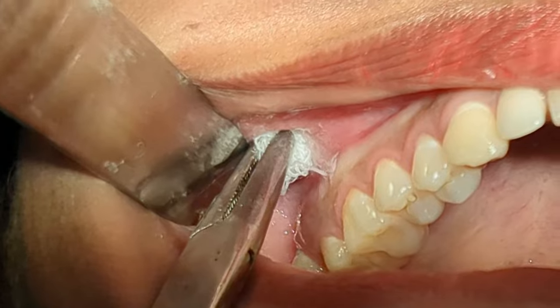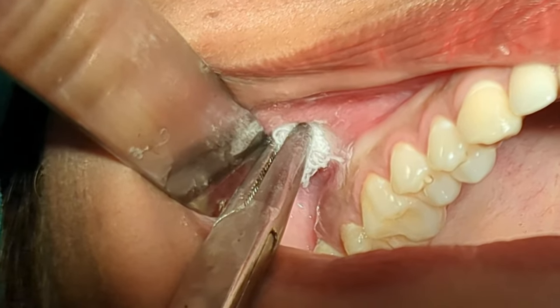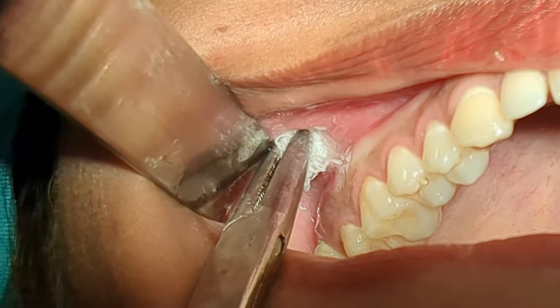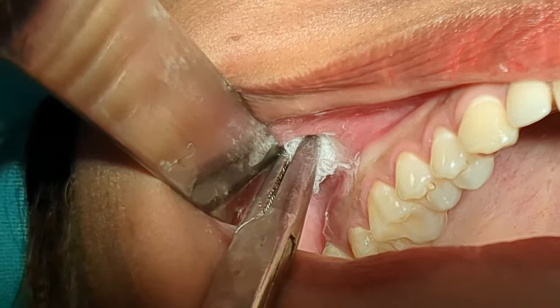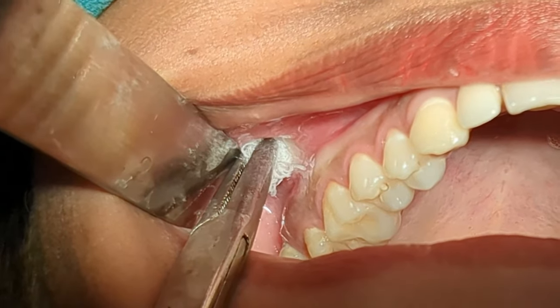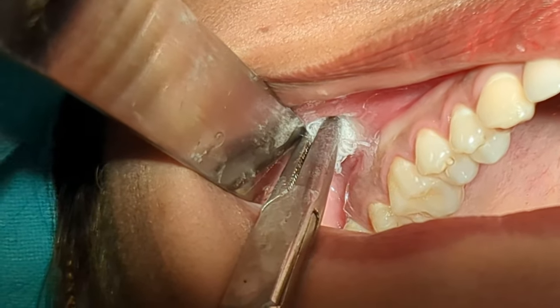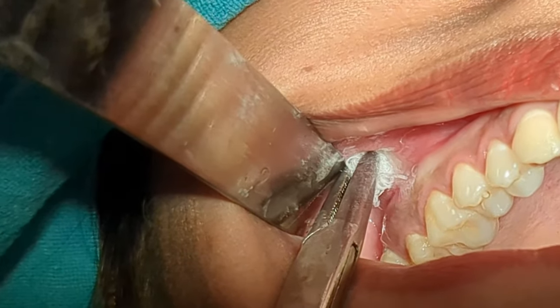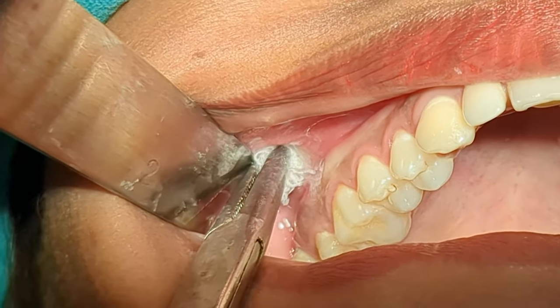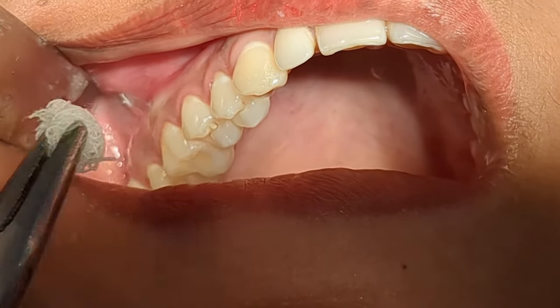I am going to keep a firm pressure. I am applying a little pressure along with the topical anesthetic so as to achieve pressure anesthesia along with topical anesthesia, which leads to a profound topical anesthesia. If I remove this, you can see there is some blanching.